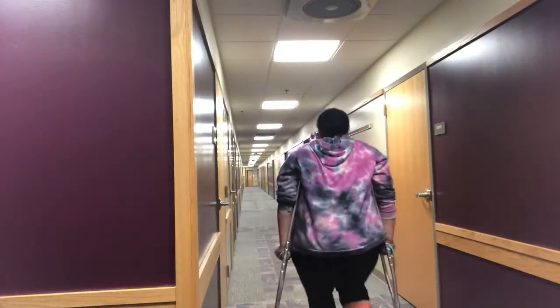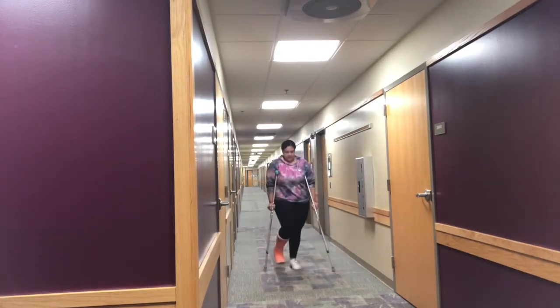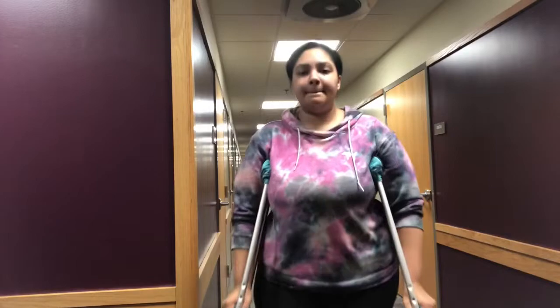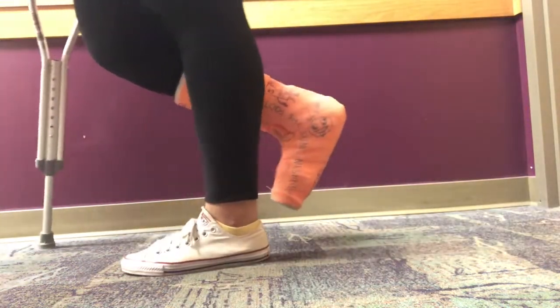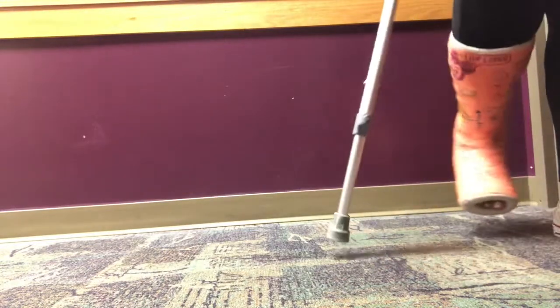This is a video of me walking up and down the hallway — this is week six of being on crutches, and it didn't look like this when I first got them. When you first get your crutches, keep your foot very low to the ground and take as small steps as possible. Don't go overboard — larger steps like I'm taking now are much faster but quite dangerous for beginners.